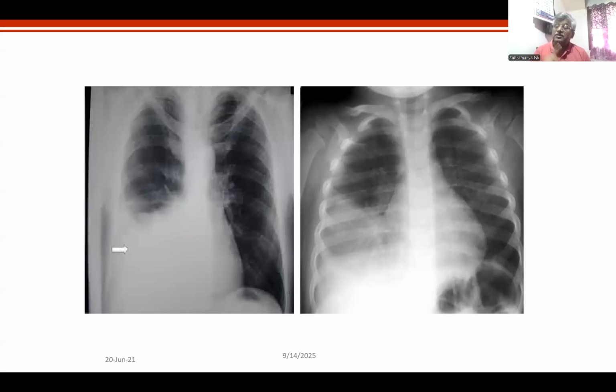Mind you, in one of the conferences in Surat recently, we could diagnose, there was a confusion between whether the pen was in the pocket or there was a pen inside the chest. I could make the diagnosis in the open conference without being told anything because of these signs which we applied and a lot of common sense. Actually, the child had swallowed a pen and had vomited. At that time, the pen perforated the esophagus and came up to the upper lobe, which we could diagnose only because of perfect application of your basics.